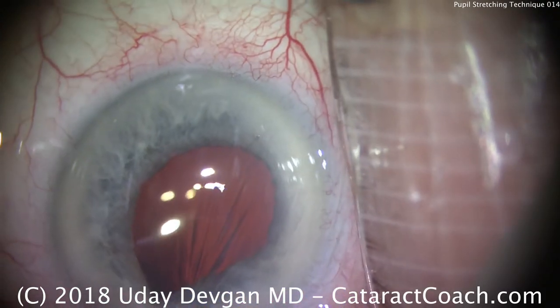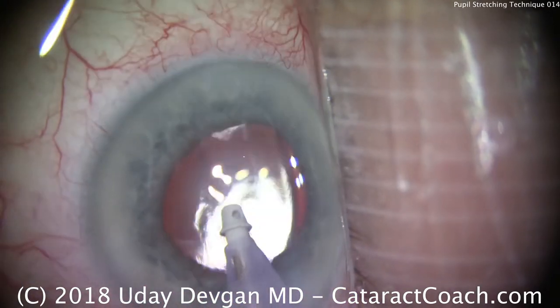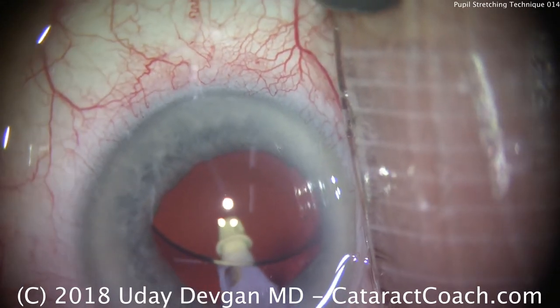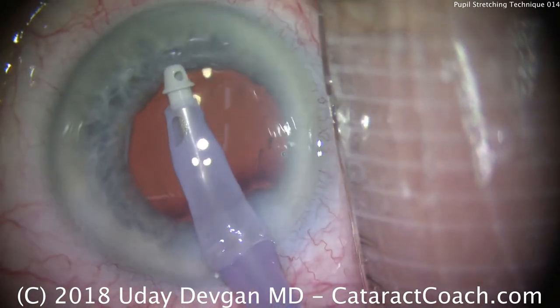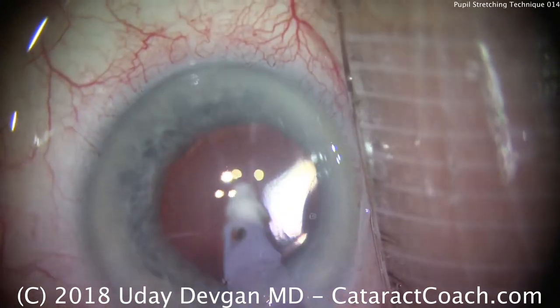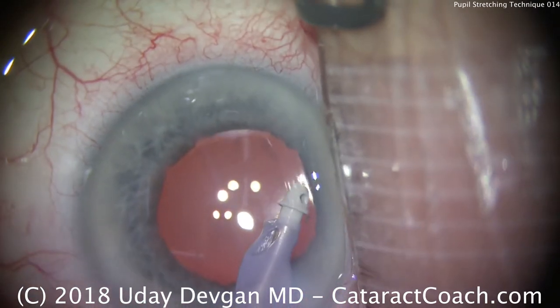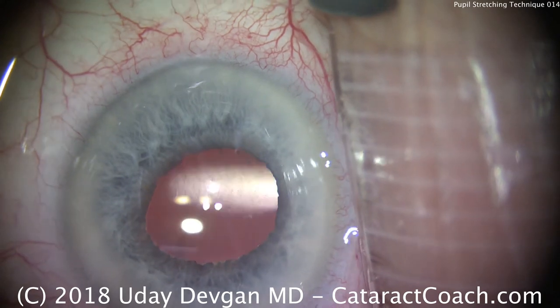That's clean — we're happy there. We'll put the I&A probe in, take out our viscoelastic including from behind the IOL. At the end of the case, we'll hydrate the incisions, and we'll be careful not to let the iris prolapse out of the eye — it is a floppy iris syndrome case, after all. The IOL is securely placed within the capsular bag. We're removing the rest of the viscoelastic from the anterior chamber. Important case to learn a few techniques: the technique of pupil stretching is something most cataract surgeons can pick up early in their careers, and it will serve you well for challenging cases just like this one.